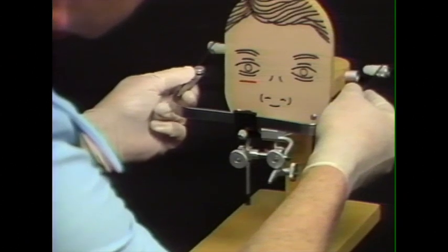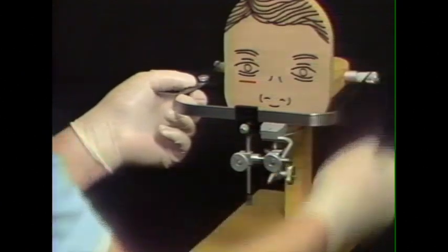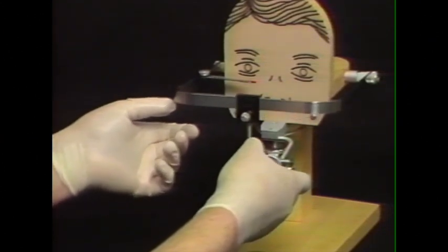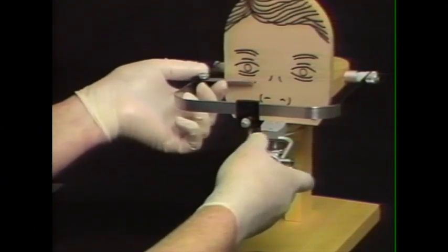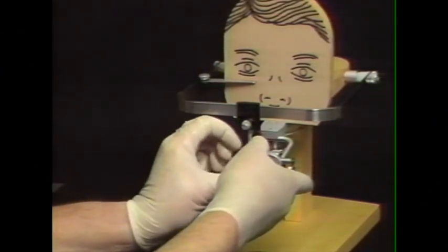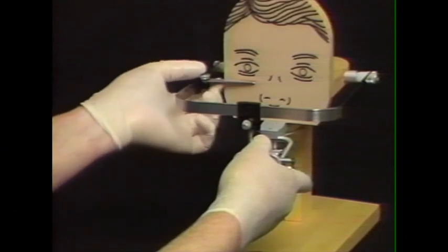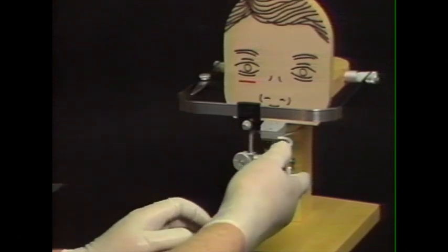and spread the Facebow so that we can insert the ear rods into the ear holes, the external auditory meatus, and raise and lower the Facebow until the axis orbital indicator is at the proper vertical location. We can then tighten this vertical rod clamp, number 1, to secure that relationship. We no longer need that indicator anymore because that dimension is set.